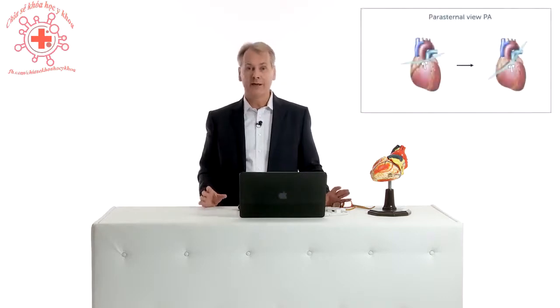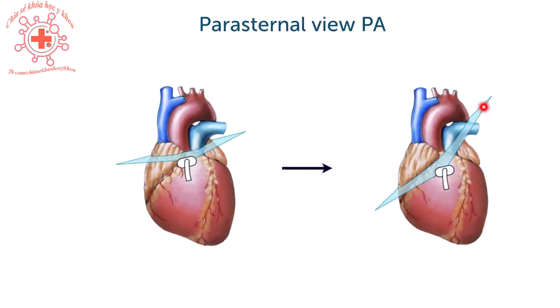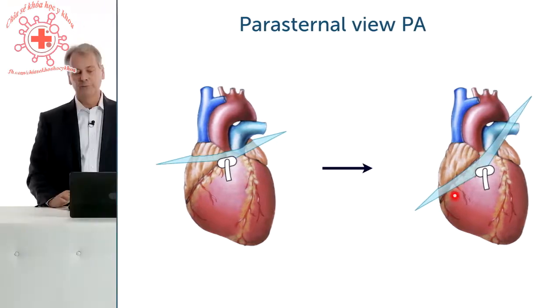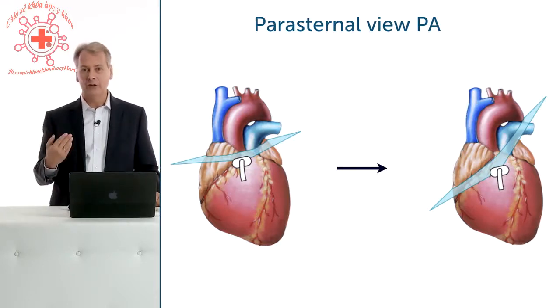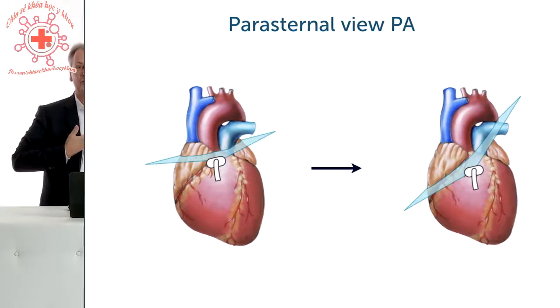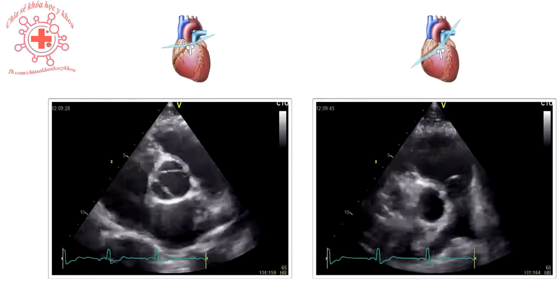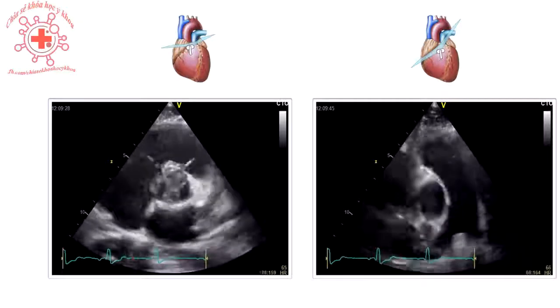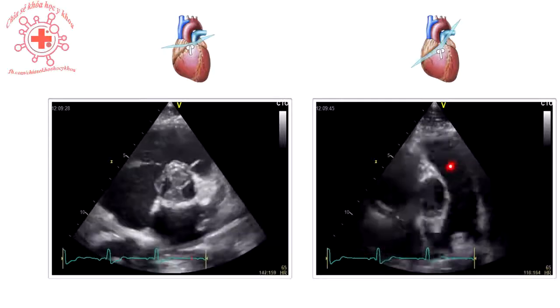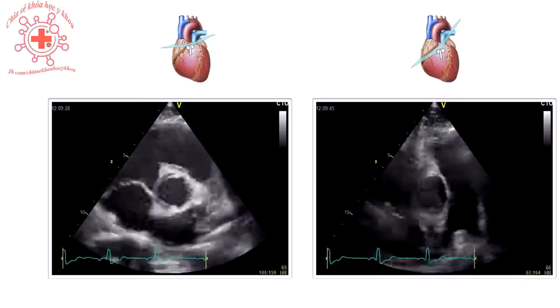From the parasternal short axis view, you just have to perform a small maneuver to get a better view of the pulmonic valve. In this modified view of the pulmonary artery and pulmonic valve, the orientation is a little more oblique — you rotate the transducer clockwise and tilt a little bit to get more shallow, so you're closer to the pulmonic artery near the chest wall. Comparing the two views, you will appreciate that the pulmonic artery and pulmonic valve can be seen much better in the modified view, where you can even see the right and left pulmonic artery. Both of these views are part of a standard exam.